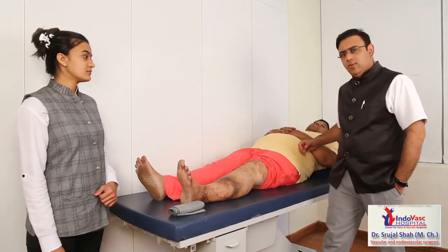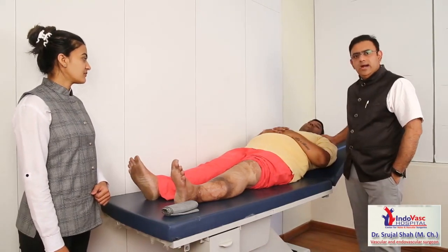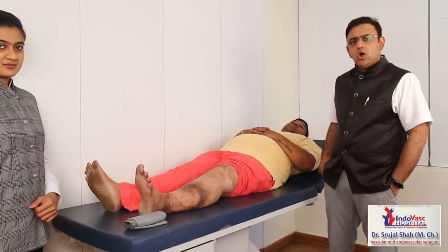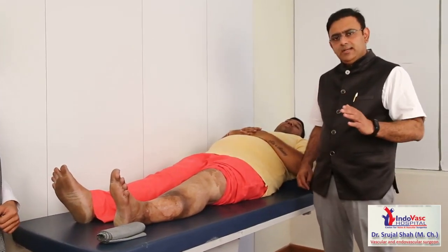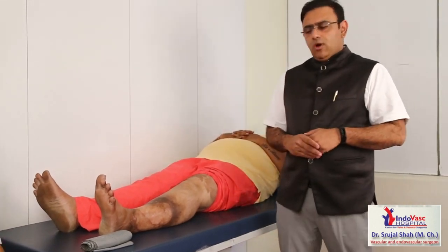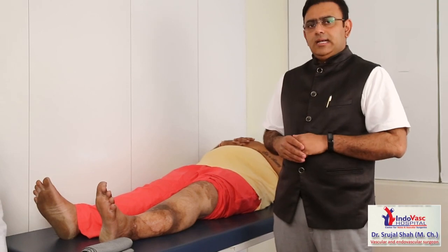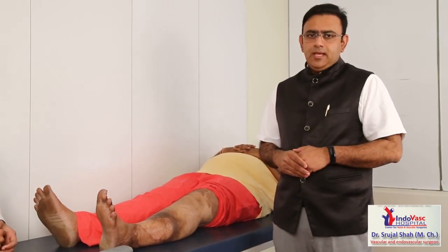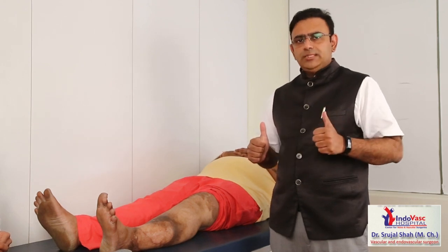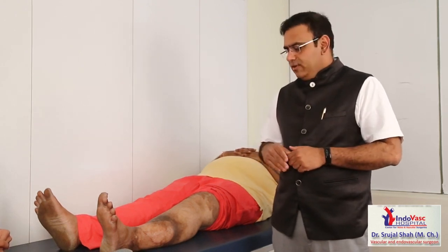This patient, Mr. Baldeo, is a young gentleman who had a chronic venous ulcer of seven years duration and it was non-healing. We did debridement and then we did skin grafting. The most important thing for maintenance of these kinds of limbs is compression.